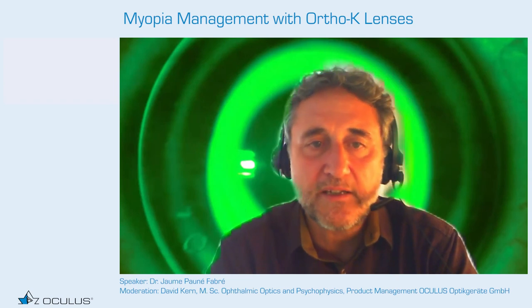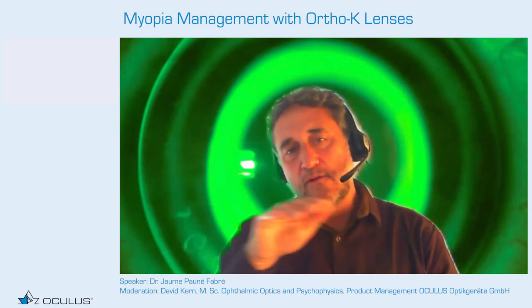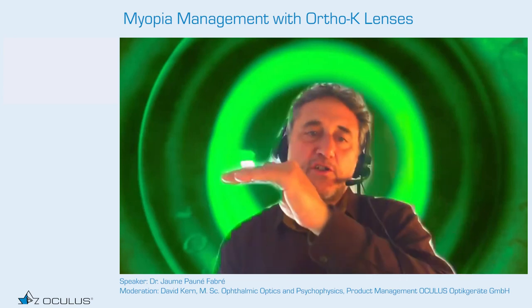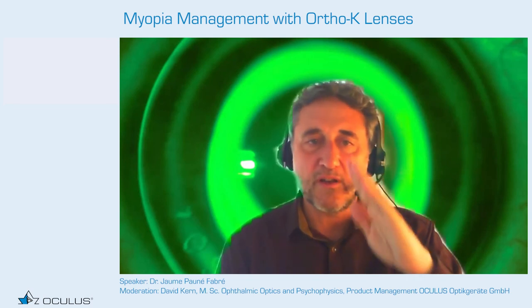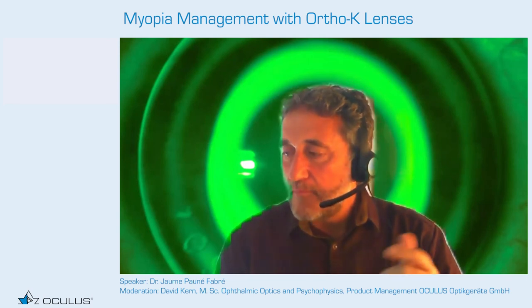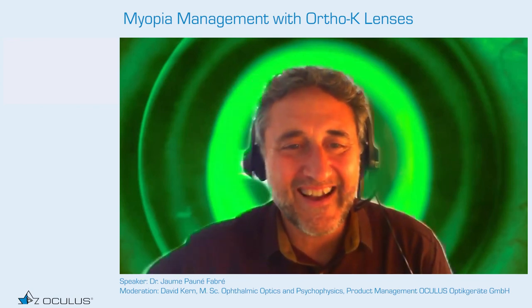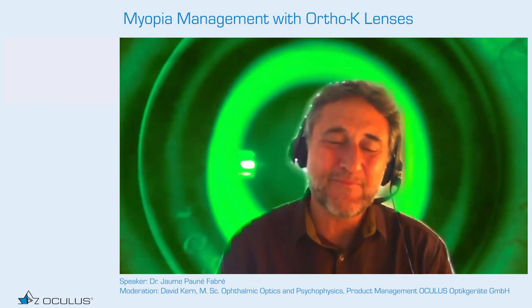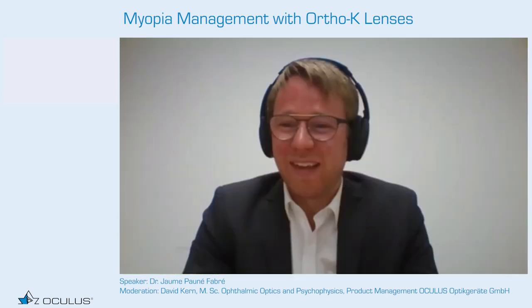So in my point of view, it's much better to look at the actual length you have at the moment, know what is normal, and know what you want to get. And then you say, we will work to obtain this projection in the future and not a different one. The previous one is more straightforward. But I don't discard it. Maybe I could combine Oculus to put the axial length growth for children with myopia in the plot to compare normal to others. Let's see the future, maybe. Yeah, thank you very much.